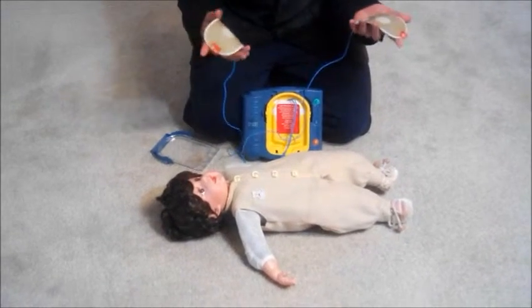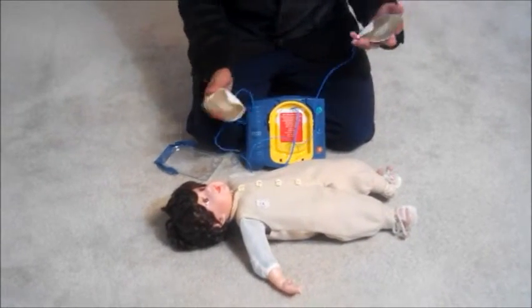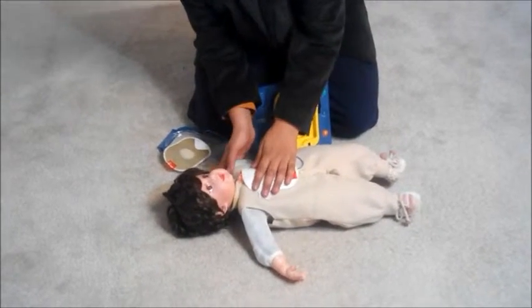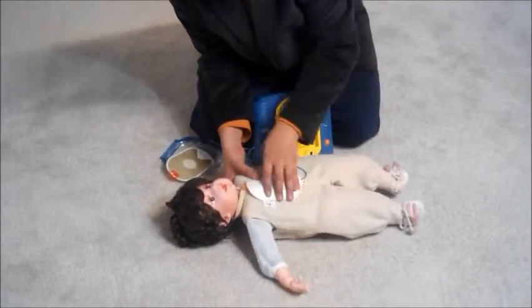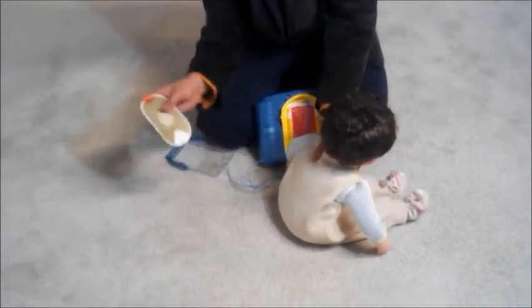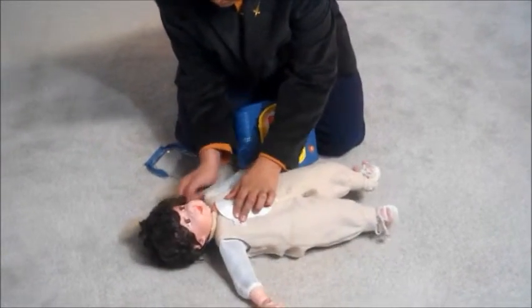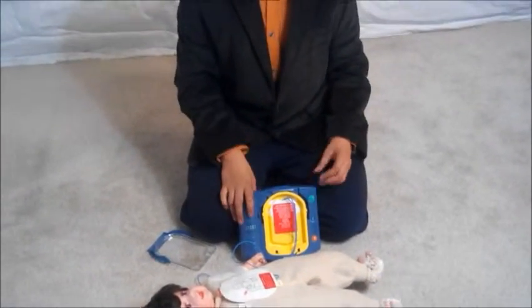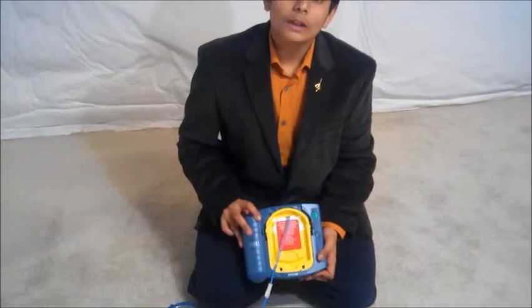So then what I do is, suppose I already removed the clothes from the patient. What I do with the child is first I place the pad in the middle of the chest of the child. Then I place one pad in the center of the child's back. And the same situation applies. The defibrillator will either tell you if a shock is advised or not. Then simply press this flashing orange button for it to shock.